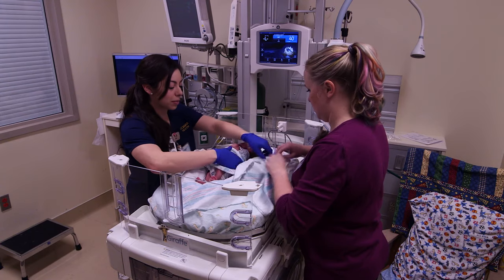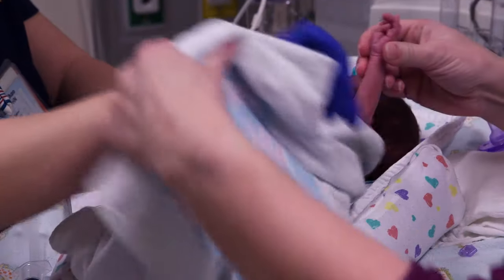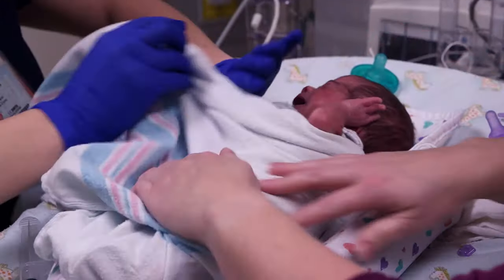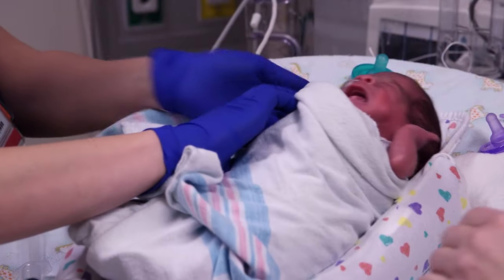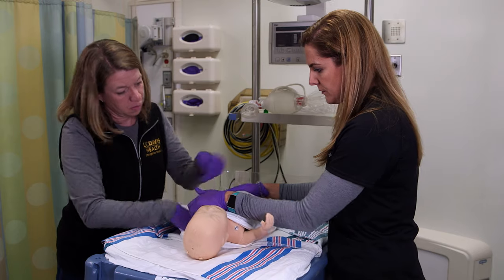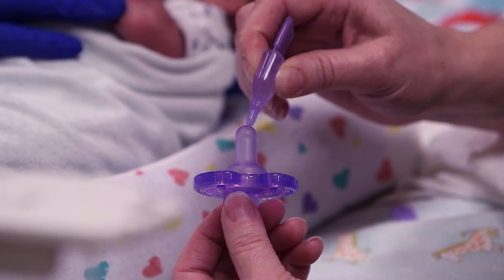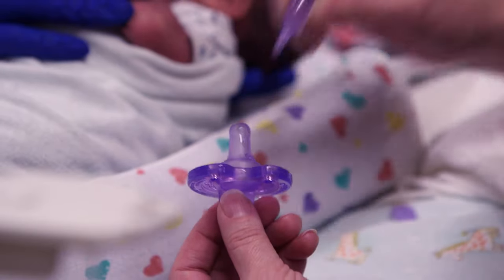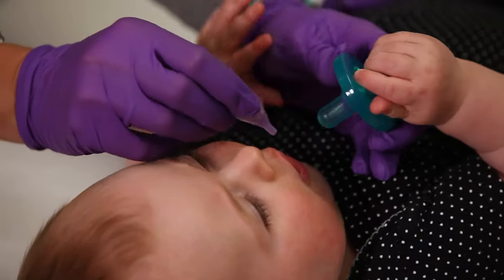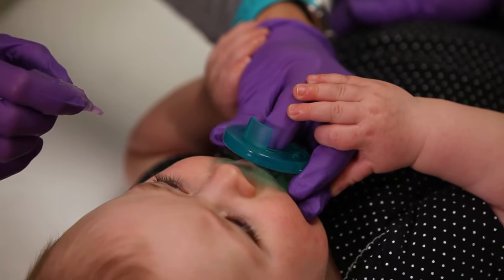Keeping the infant still is one of the most important steps when placing an IV. The burrito wrap or papoose using a sheet works well by limiting movement of the torso and extremities. An additional person may be needed to help hold the infant while you wrap. For infants under six months of age, a concentrated sucrose solution can help to soothe them. A pacifier, calming music, or breastfeeding can also be comforting.